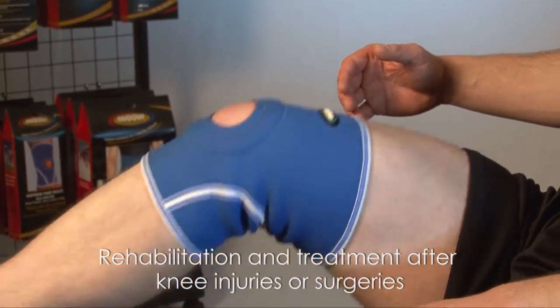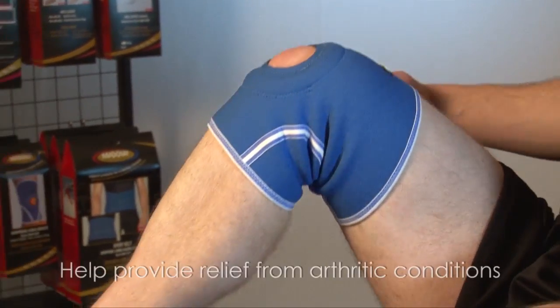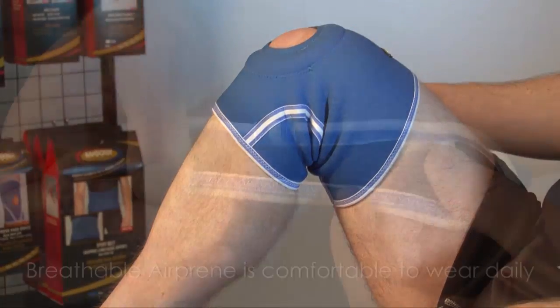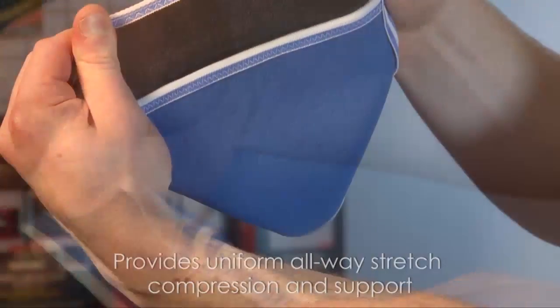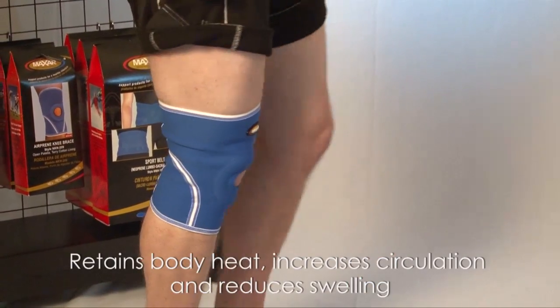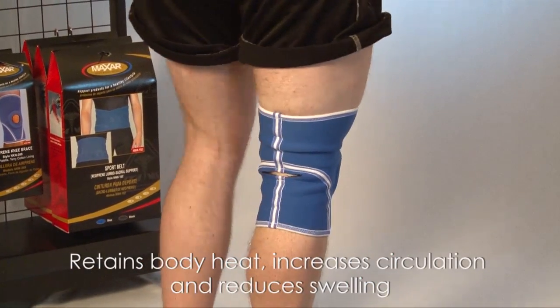Rehabilitation and treatment after knee injuries or surgeries help provide relief from arthritic conditions. Features include breathable AirPrene that is comfortable to wear daily, provides uniform all-way stretch compression and support, retains body heat, increases circulation and reduces swelling.